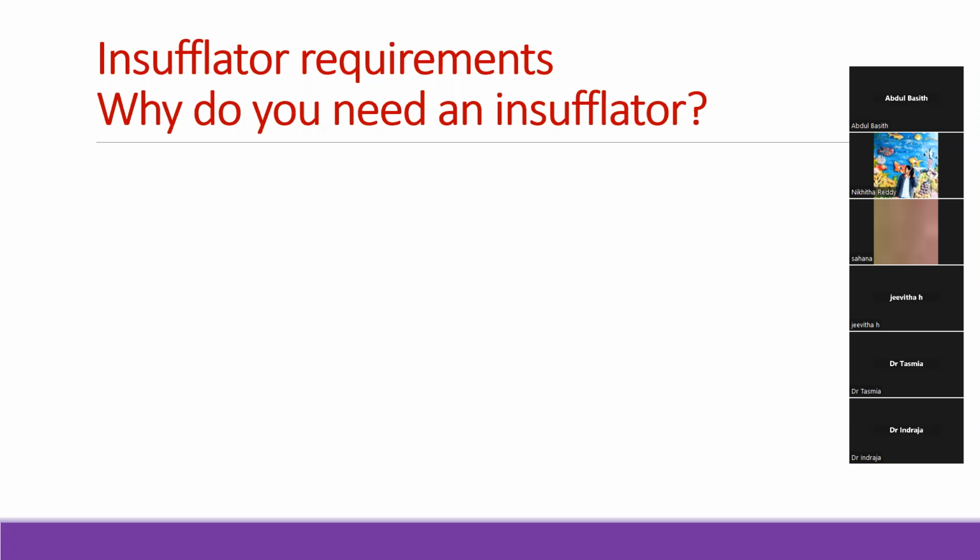In so many areas around your instrument, even with all these flap valves and washers and all that, it can leak, and so it is inevitable. And so that is why you need an insufflator. So if you need an insufflator, what are the things you expect the insufflator to do? What are its responsibilities? Or what is its job?